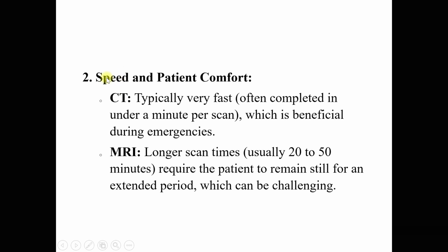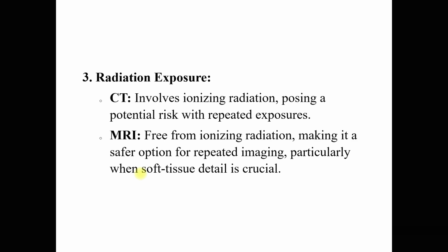The second point is speed and patient comfort. CT is typically very fast, often completed in under a minute per scan, which is beneficial during emergencies. While MRI has longer scan times, usually 20 to 50 minutes, and requires the patient to remain still for an extended period, which can be challenging. The third difference is radiation exposure.